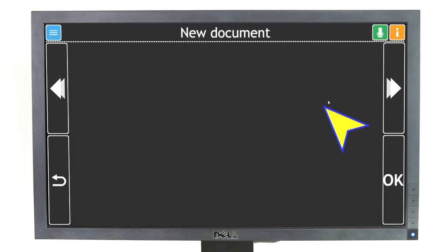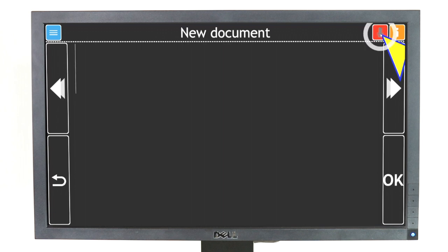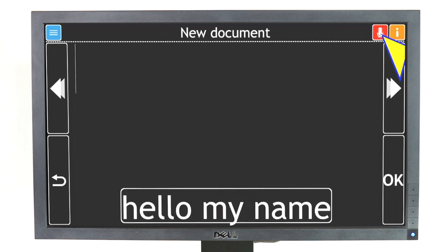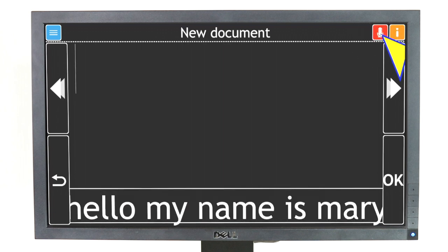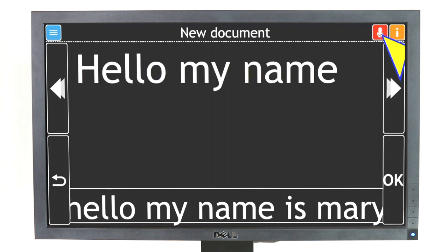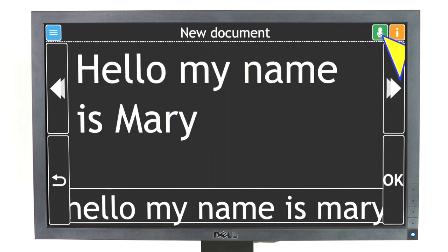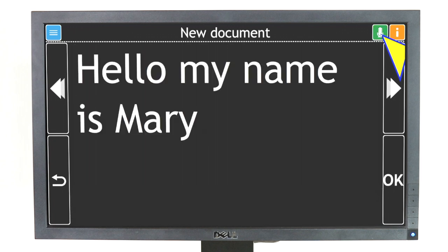GuideConnect will play a sound and you can start speaking your text — for example, "Hello, my name is Mary." After a three-second pause, GuideConnect will stop recording and your spoken text will be written on screen.